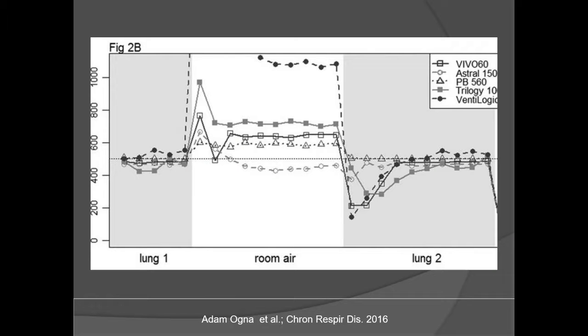And I'm very happy to show you this study from Adam Onya in 2016. And you can see here patients using the ventilator, here disconnecting from the mouthpiece, but here look what happens when patients are reconnecting to the mouthpiece.